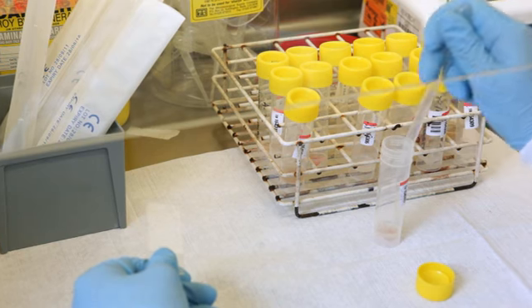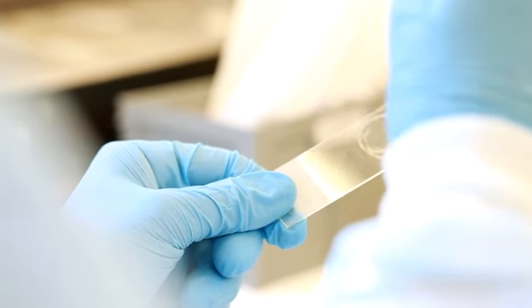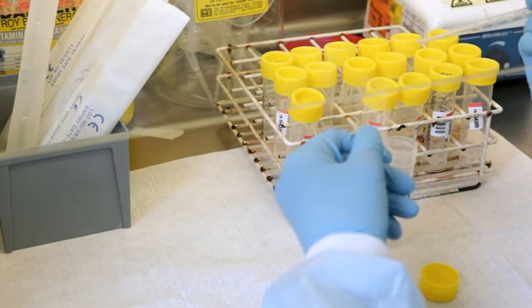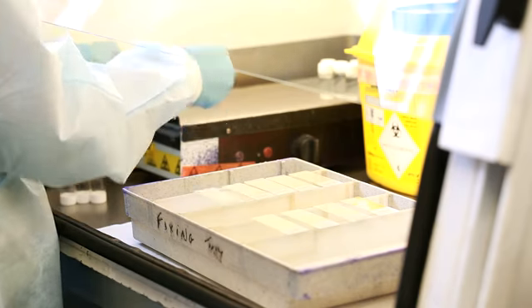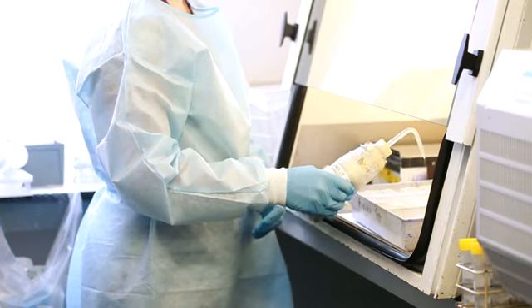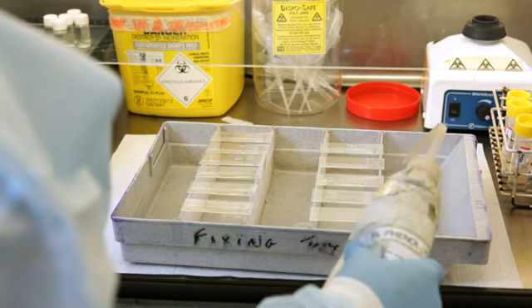Once spun, the supernatant is removed, leaving a pellet of concentrated material at the bottom of the container. A thin monolayer of material is placed on a slide. The slide is placed on a hot plate for a minimum of 10 minutes to fix the material to the slide. The slide is then treated with a solution containing phenol for 5 minutes to render the material non-infectious, thus allowing laboratory staff to handle the slide safely. This part of the process takes approximately 45 minutes.